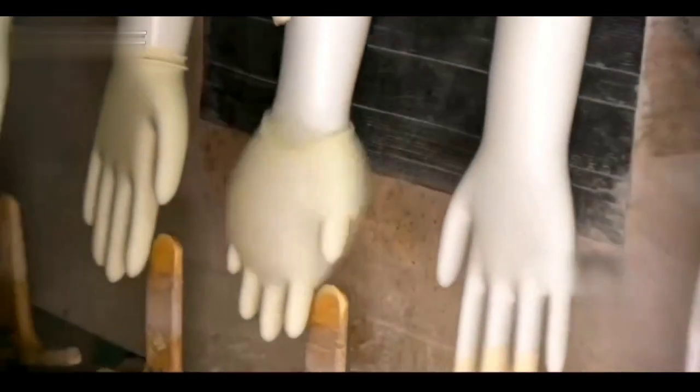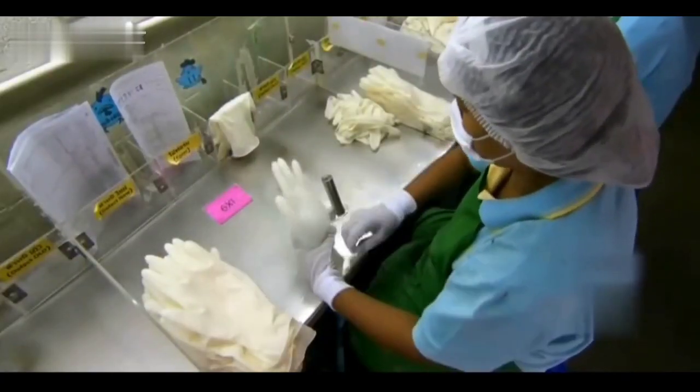Natural latex gloves, on the other hand, are removed from the mold with light pressure and a gentle blow.